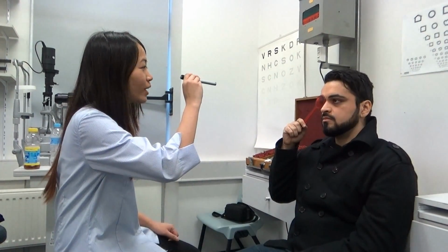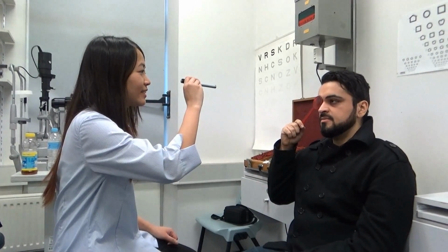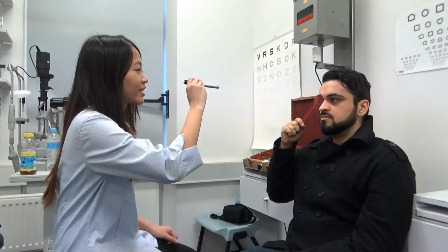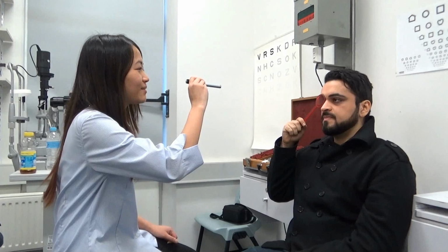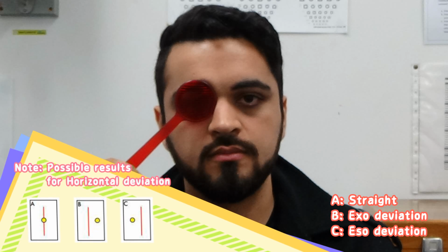So Emad, where is the light in regards to the vertical red line? It's on the right. On the right? Yep. To measure the horizontal deviation, the Maddox rod is placed in front of the right eye with the cylinders horizontal. Therefore, the red line will now be vertical. The patient is asked whether the white light is superimposed on the red line or if it is to the left or to the right of the red line.